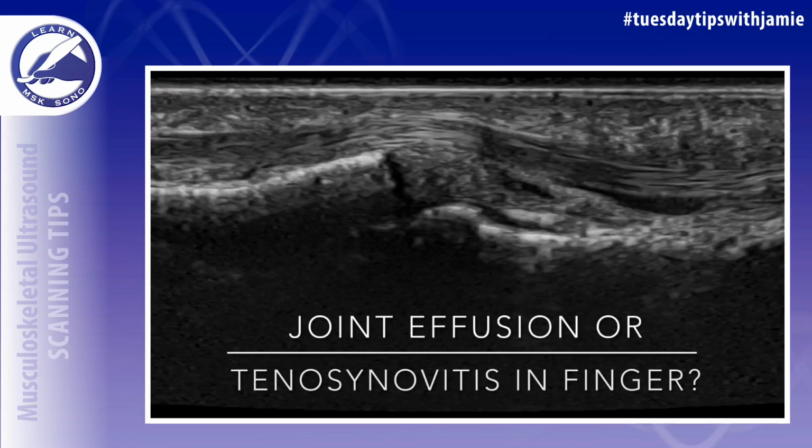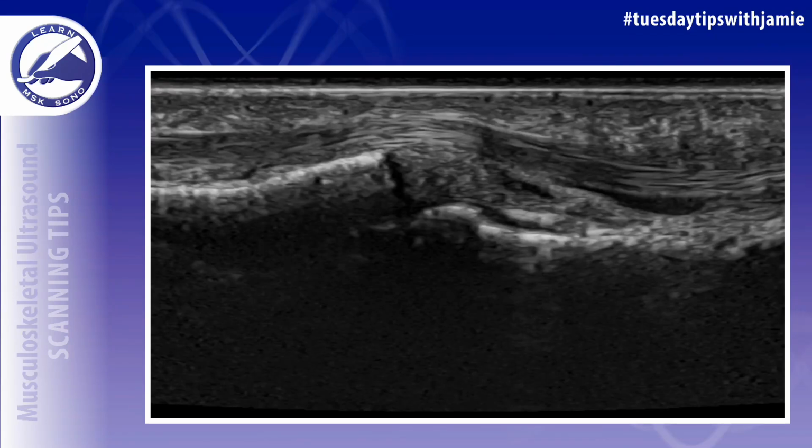How can you differentiate between joint effusion and tenosynovitis on your MSK ultrasound exam of the hand when fluid is visualized on the volar surface of the finger?